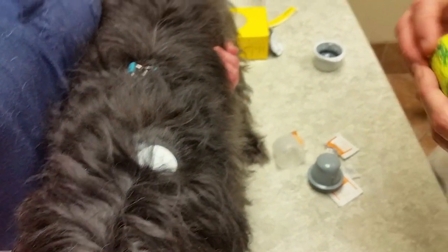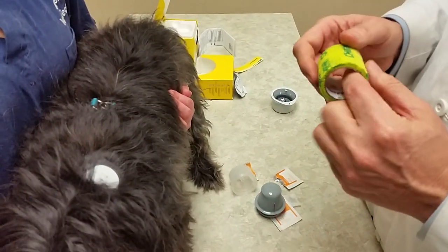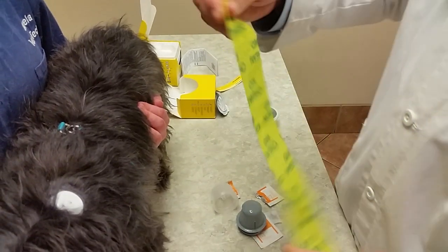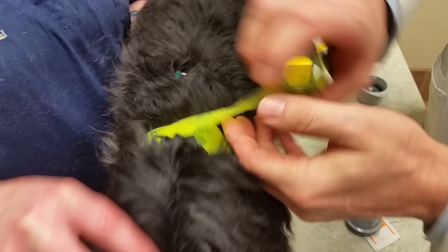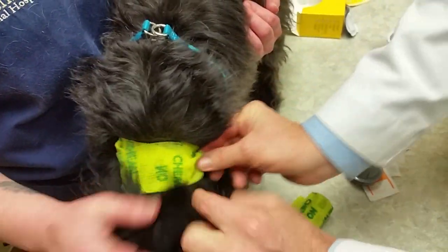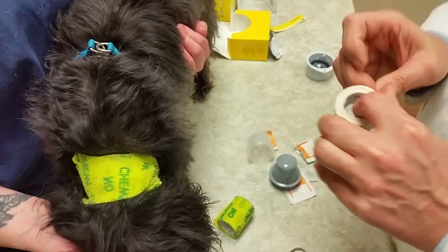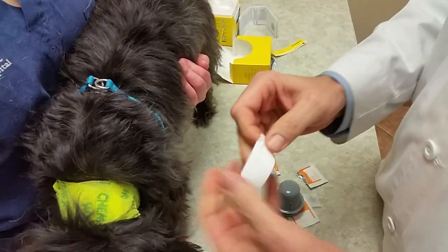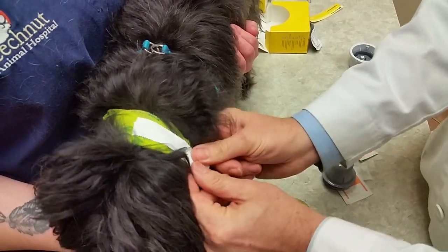At this point we tend to cover these up. I don't know that you have to, but we do. So we just wrap that around very loosely, and now that's ready to go.